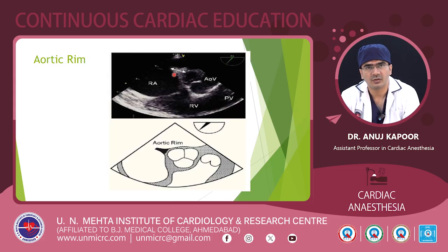Fourth, the aortic rim. This is a very important rim for device closure, though it is not mandatory, but we want it to be at least 5 mm or above, so that we have a good deployment of the device. To achieve this, we use the mid-esophageal aortic valve short axis view.